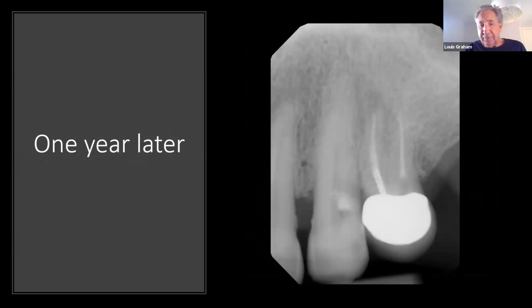This is our treatment of number 11, no periapical changes. We laid a flap, put an RMGI in, and she's been asymptomatic. She had some cold sensitivity for 2 weeks. That totally went away after 2 weeks.